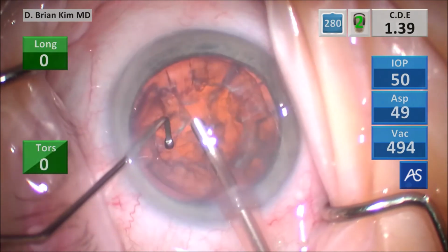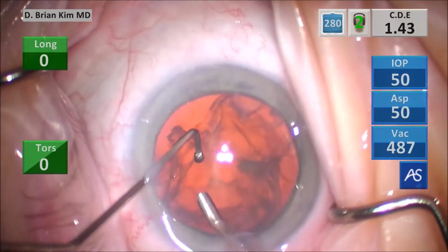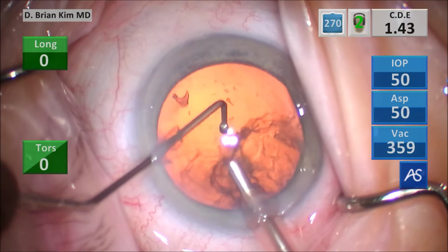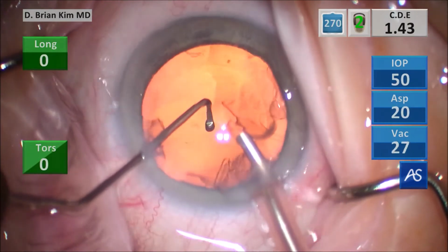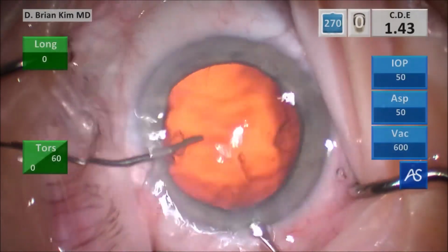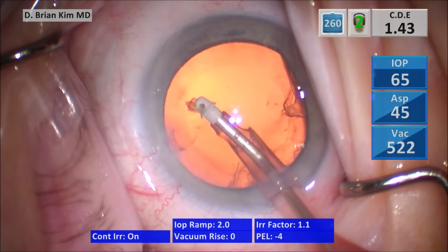You want to grab the anterior aspect of the epinucleus. Be mindful that you don't grab the bag in the process. So I take the chopper out, push BSS in, take the phaco tip out, and I go in with the I/A handpiece. A little bit of epinucleus stuck there.